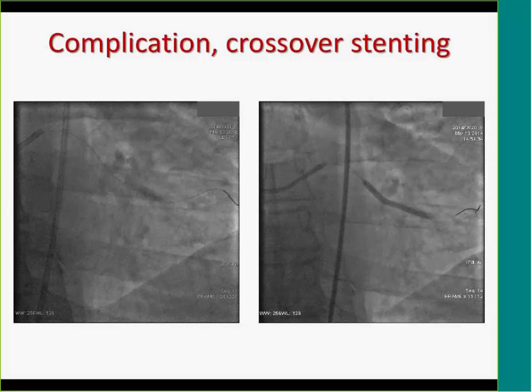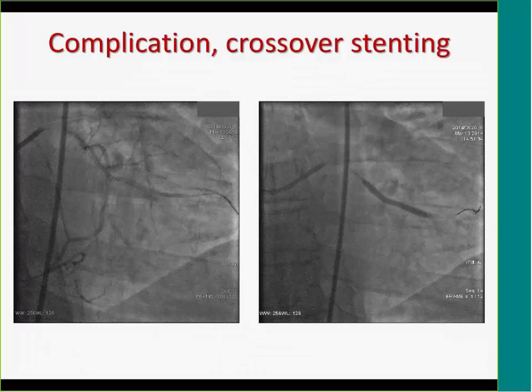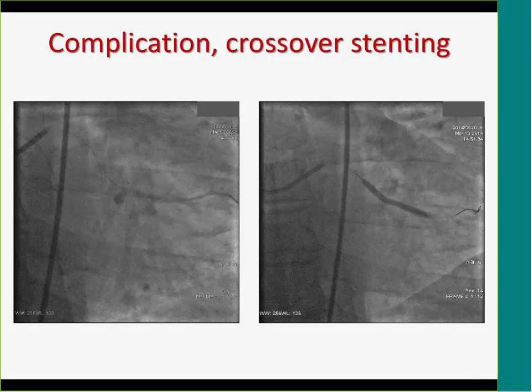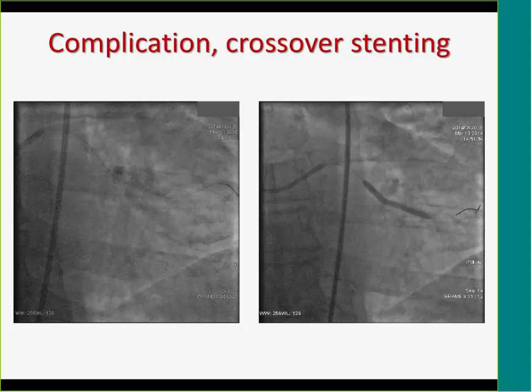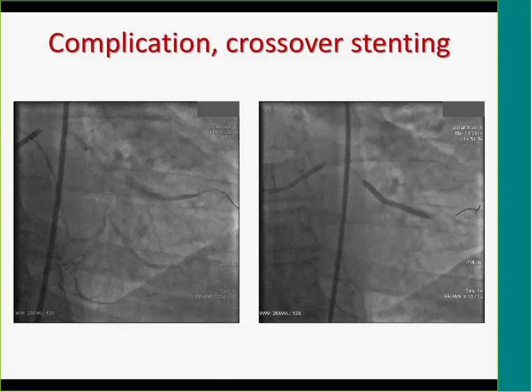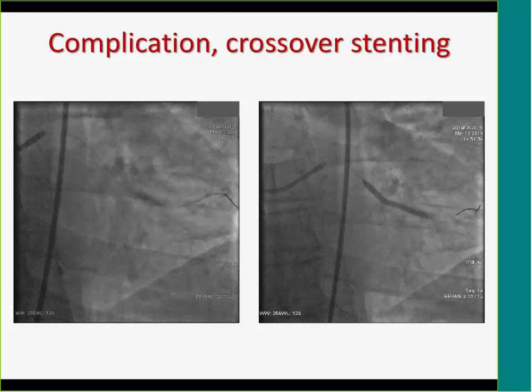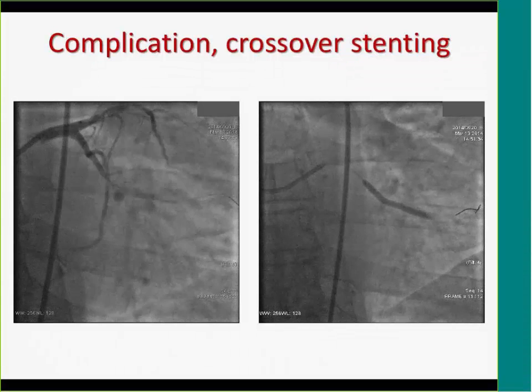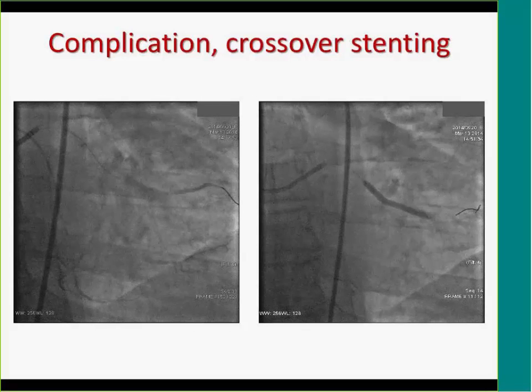So just pain, or were there segment changes? Yeah, there was severe angina and ST depression in the chest leads, and also, frankly not a cardiogenic shock, but a significant decrease of the blood pressure. So it was a really hot situation, that the only way was to stent this abruptly occluded marginal branch. I don't know whether you agree with this decision.